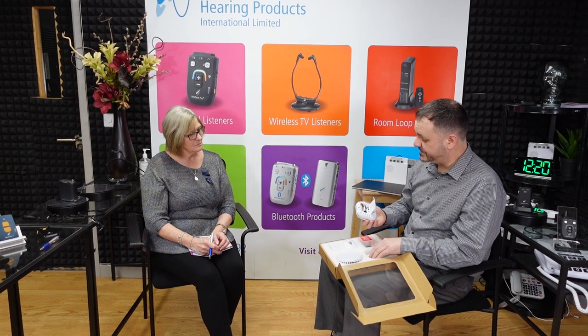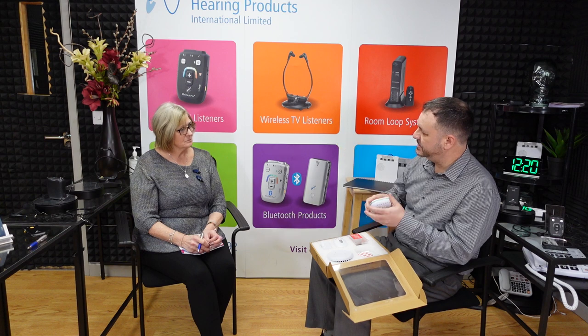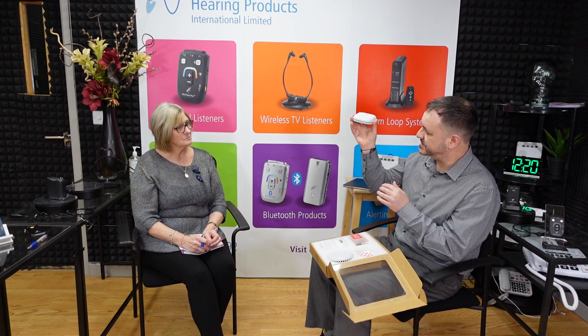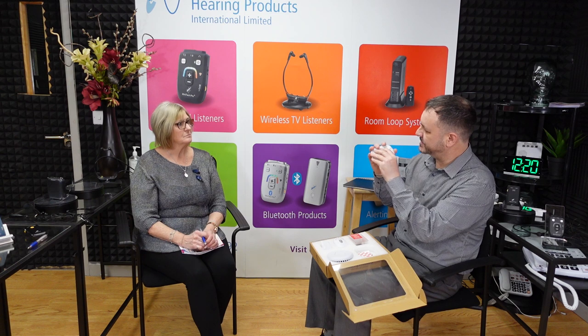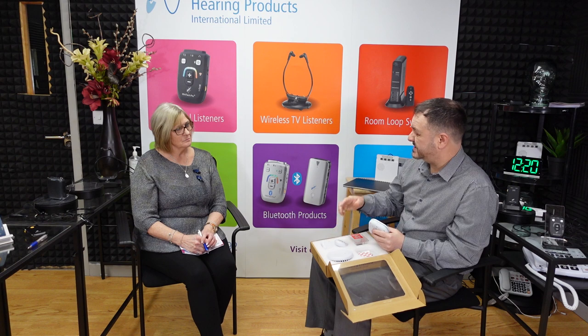Would the system work with our existing smoke alarm or would it have to be replaced by yours? You can keep your existing smoke alarm and simply put the sound sensor next to it. The sound sensor has three sensitivity settings — for example, on low sensitivity it will only pick up sounds close to it. If you place it next to your current smoke alarm and that alarm triggers, it will trigger the sound sensor, which then triggers the pager. That gives you peace of mind.